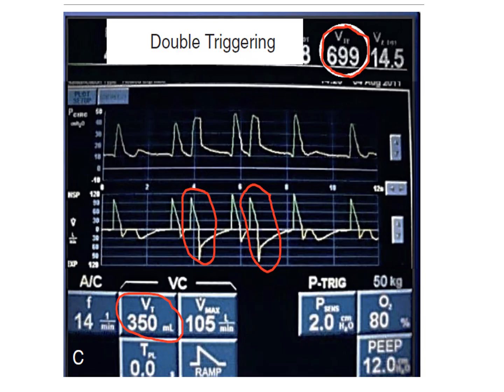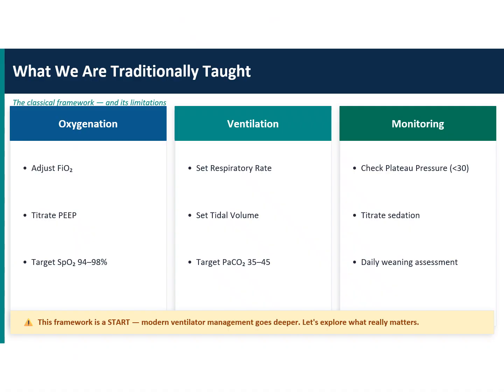Is it flow asynchrony? No, it is cycling asynchrony, because you have set a flow of 105 liters. So basically you are not giving any inspiratory time for these patients. This is quite a high flow. If you keep the flow very high, the inspiratory time will drop. The patient wants more inspiratory time, and that will lead to triggering of another breath, and that can stack on each other. That is called double trigger. So in this patient, you actually come down on the flow. This is not the right way to manage, isn't it?